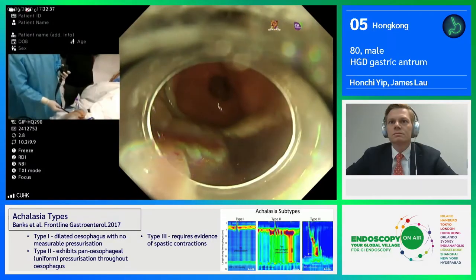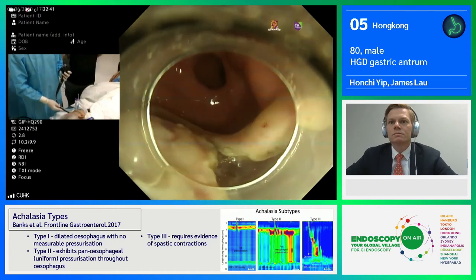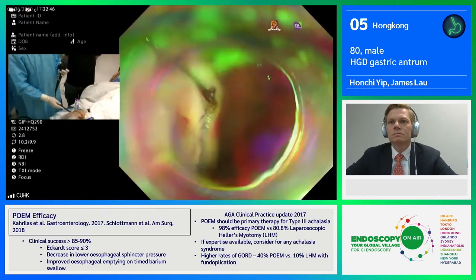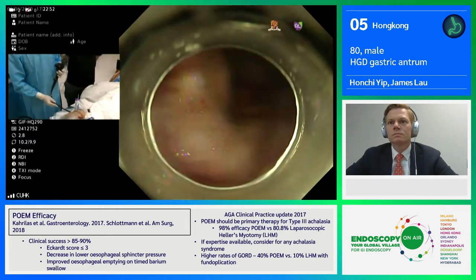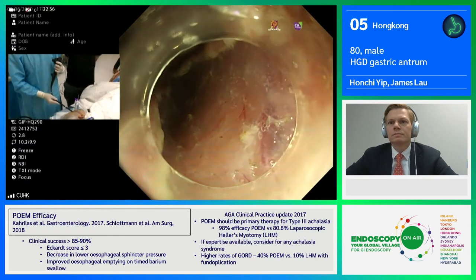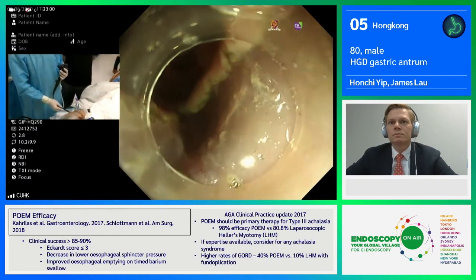Initially I used the flush knife to create two small mucosal incisions on each side of the far end. Then I used the IT2 to drag and start the mucosal incision, one towards this side and the other from here to this side. You can see I've already done trimming for this part, so you can already see the exposed muscular layer.